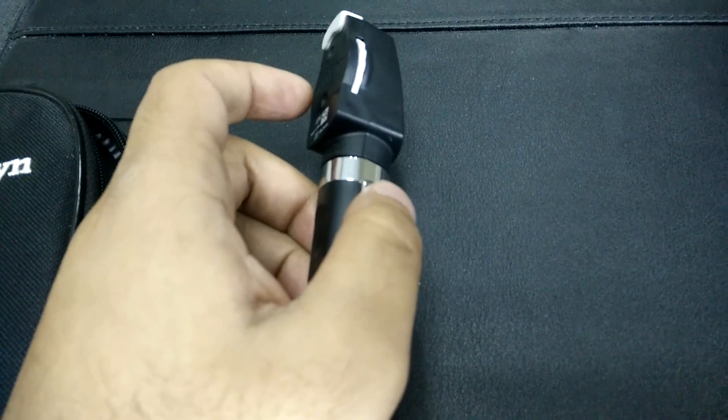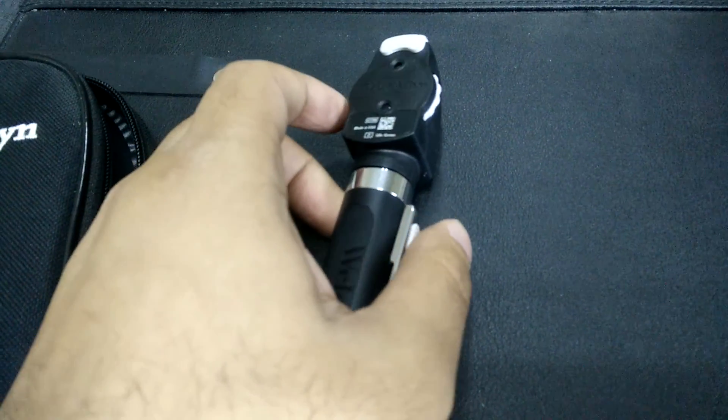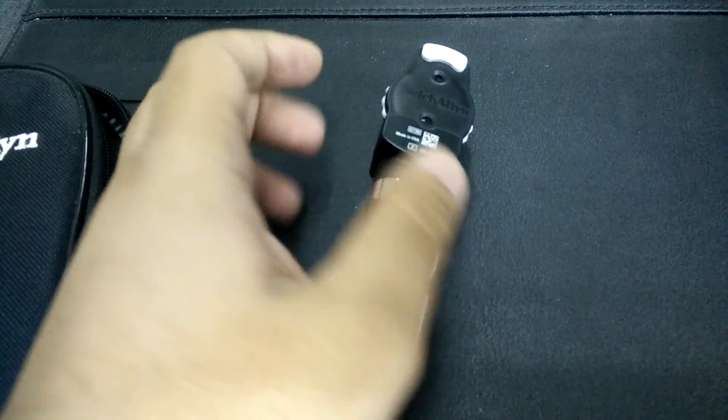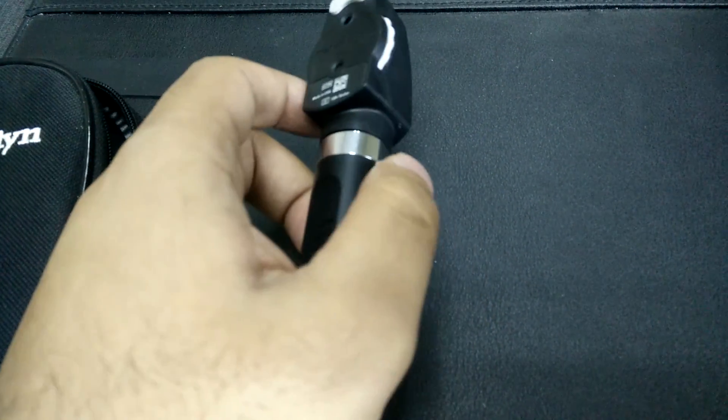Compared to other bulbs like the Xenon bulbs you commonly see in larger ophthalmoscopes, and also the pocket versions of the Hain which require regular replacement, I don't think there is a need for replacing this LED bulb as of yet.